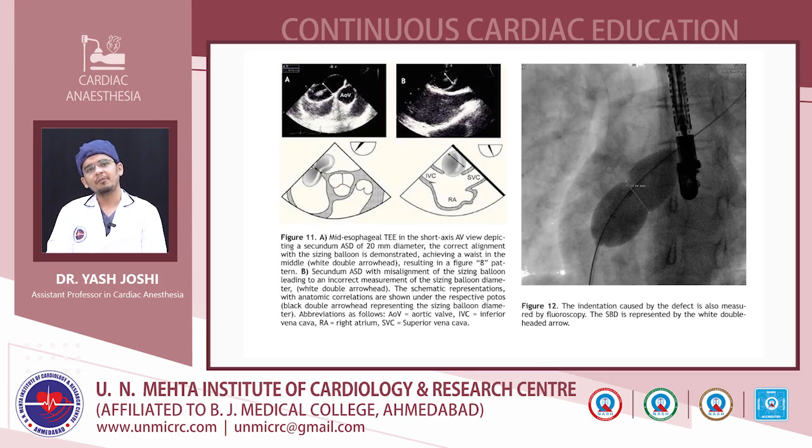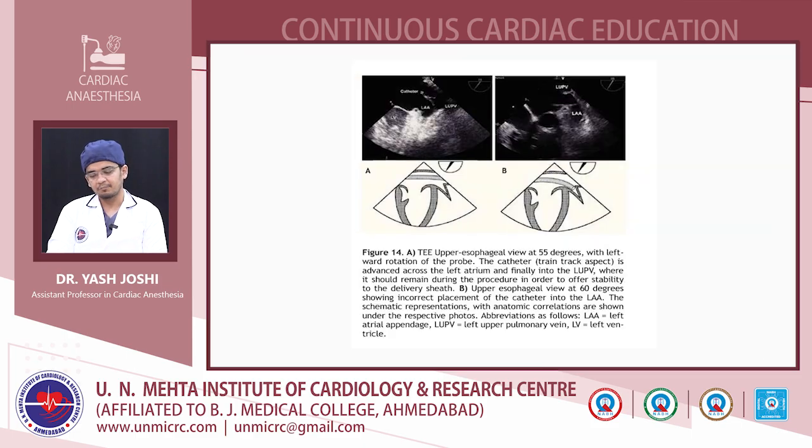While in the second figure, we can see the balloon is placed above the defect, and it takes a circular or oval shape. So, it always overestimates the size of the defect, and thus it is not useful for proper sizing.